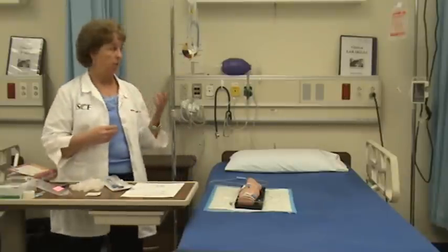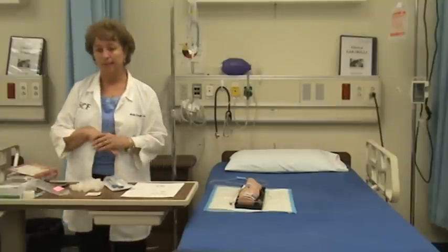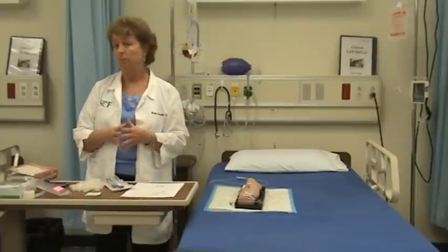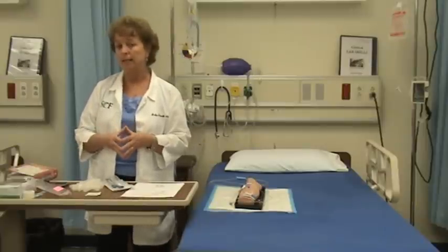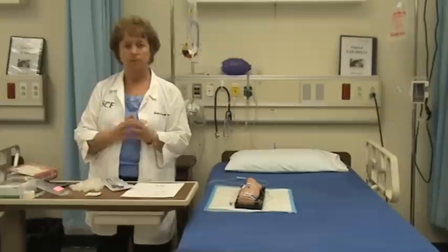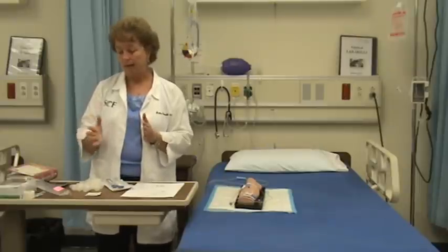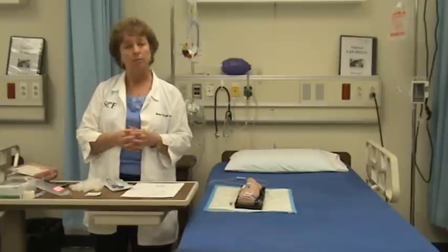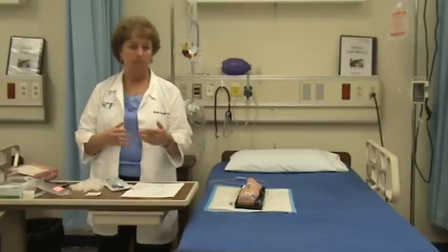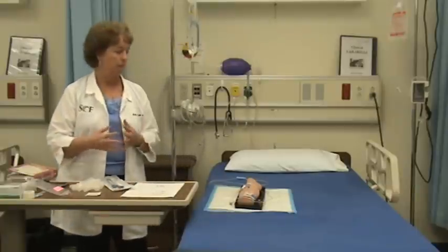Now if the patient had an IV pump, to give this over a half an hour I would need to set the pump rate at 200 milliliters per hour, because pumps are set at an hourly rate, and then in one half hour the 100 milliliters will be gone. So whether I'm giving it by pump or by gravity will change how I do my math.